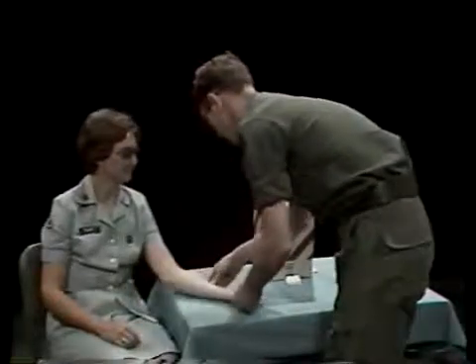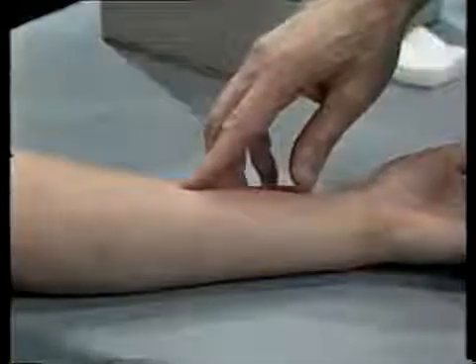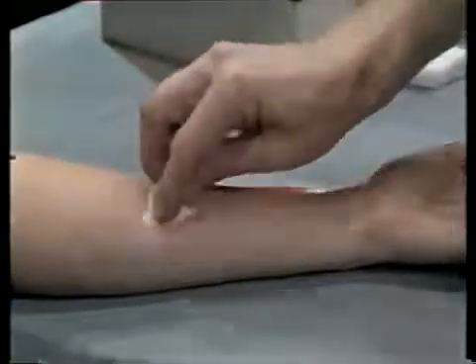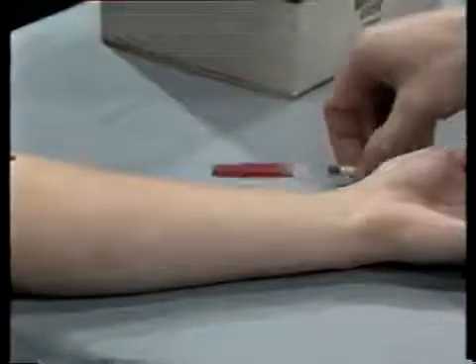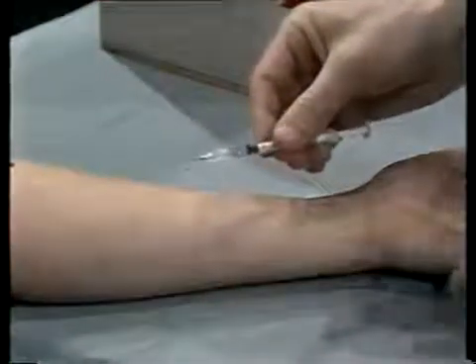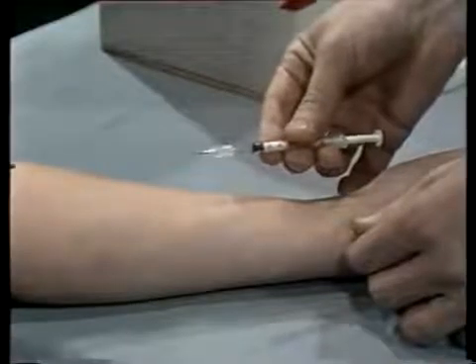For an intradermal injection, select a site on the inside of the patient's forearm — the side which would be exposed when the hand is palm up. With a sponge wet with disinfectant like ether or acetone, cleanse the injection site using a firm, gentle circular motion, cleaning outward in a spiral. Now pick up your syringe, remove the needle guard, and hold the syringe around the barrel. The bevel or cutting edge of the needle should be facing up.